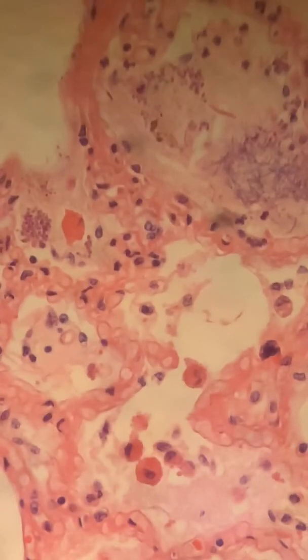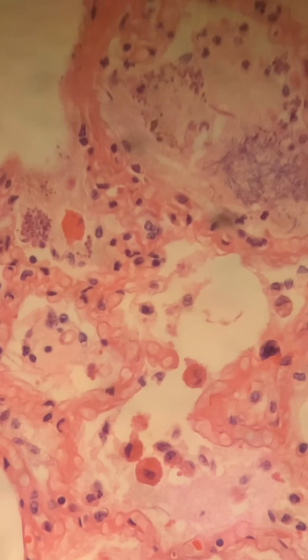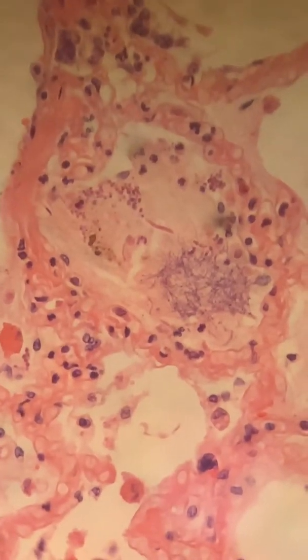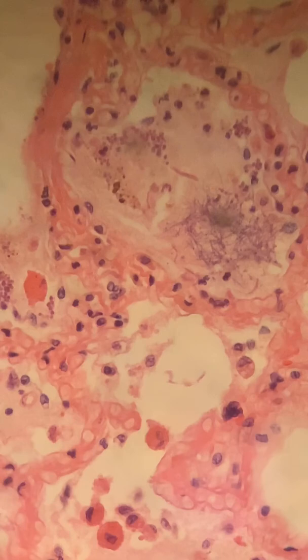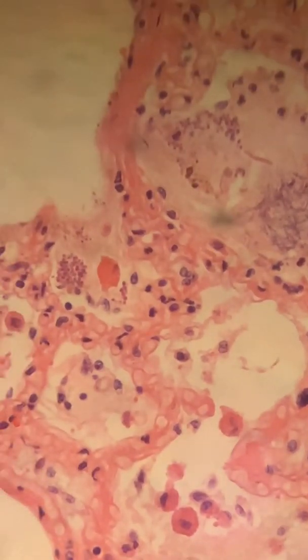This is a demonstration of lung tissue showing a Candida-like fungal infection or pneumonia. And you can see the organisms in the alveolar spaces there. It is mixed with some colonized bacteria, but the organisms are actually present within acute inflammatory response and histiocytic cells.